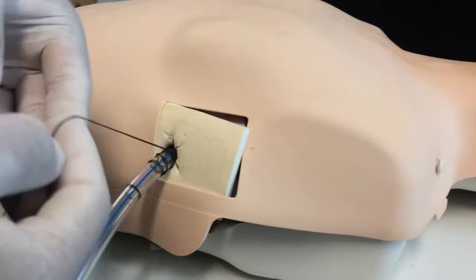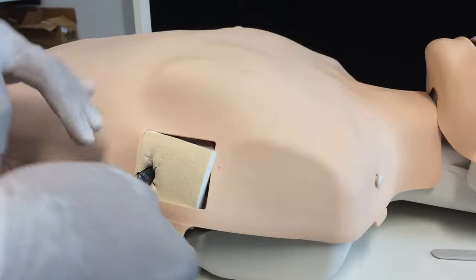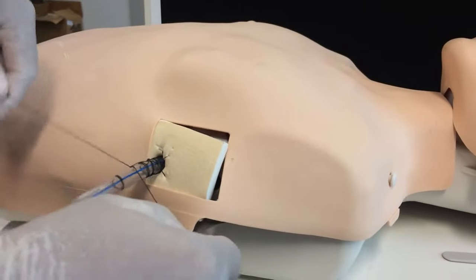And then you just secure it as you would do normally, using whatever method you want to. I'll just put a couple of throws in.